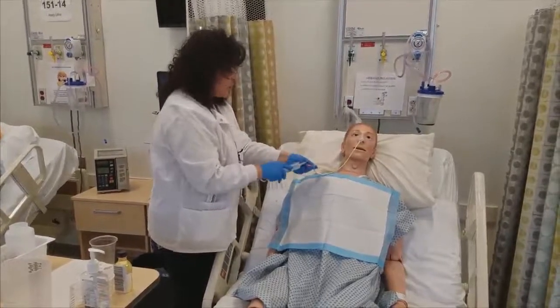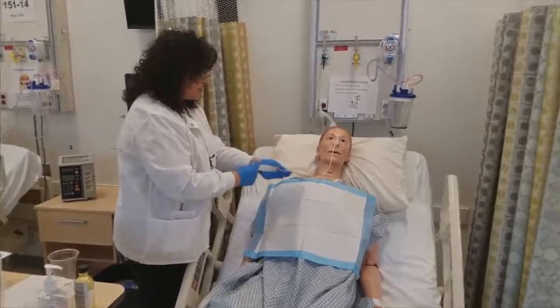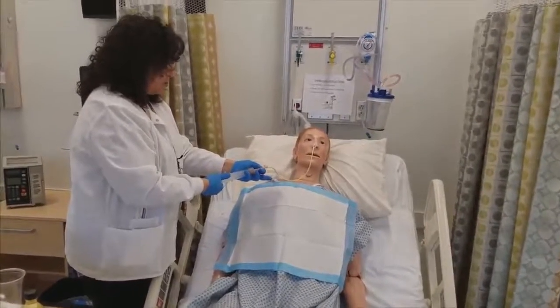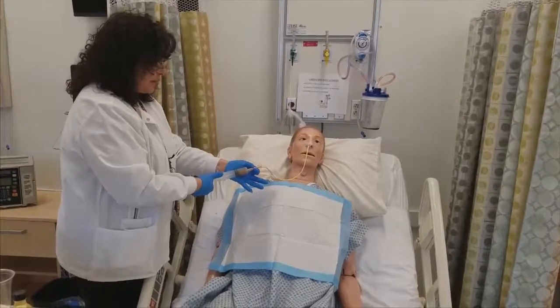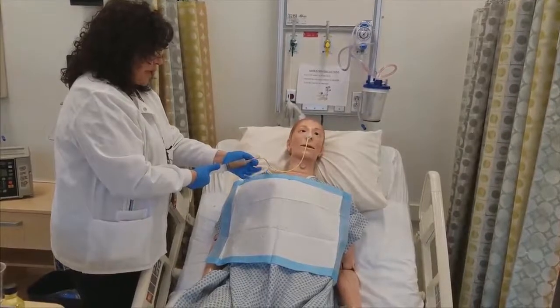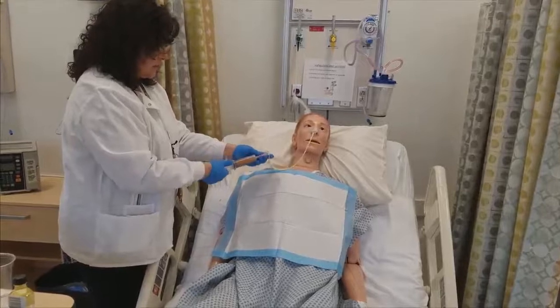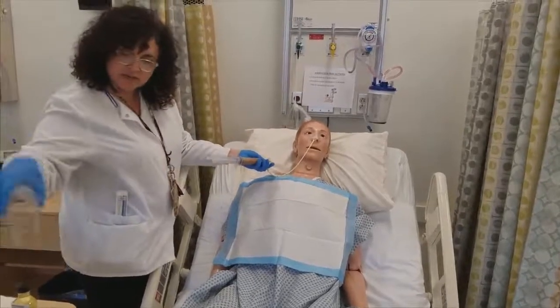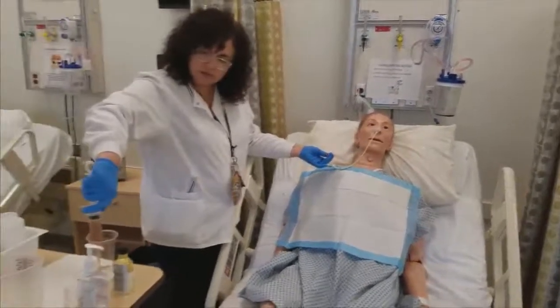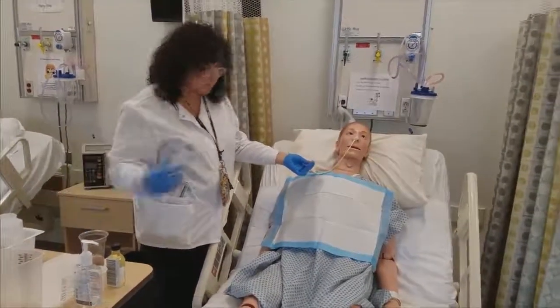We have to make sure that we always start with air. So I'm going to put a 30 milliliter bolus of air in first, and then I'm going to pull back very gently. And that will prevent the tube from collapsing, and it'll allow me to pull back aspirate from the stomach. All right, so pulling back, I see the tube feeding formula, and I have filled my syringe. I have a nice clean graduate container, so I'm going to transfer this volume to my graduate container and then continue aspirating.